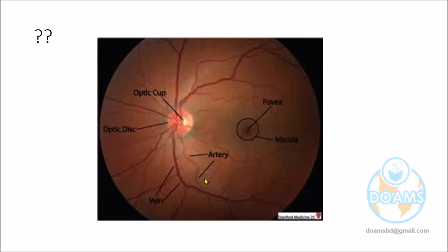Overall the background is black. Is anybody from our colleagues from Sudan today? Maybe you are from India or Pakistan. Okay, Dr. Shazia or anyone. So the previous one is a non-black person's retina, and this is a black person's retina. Usually it is also normal. So don't be confused. Okay, this is normal. Don't be confused.